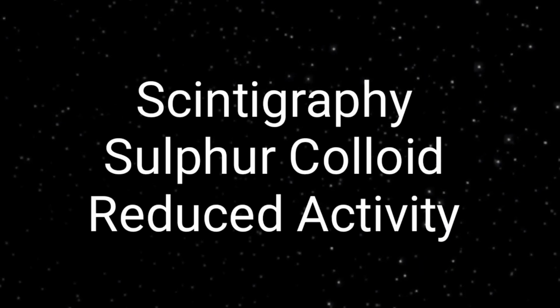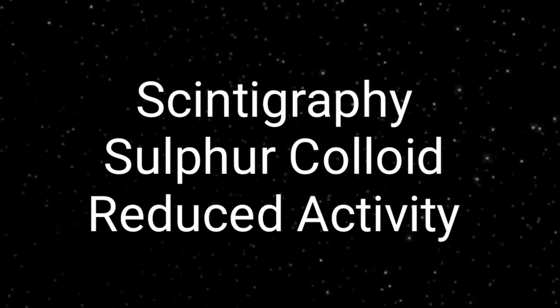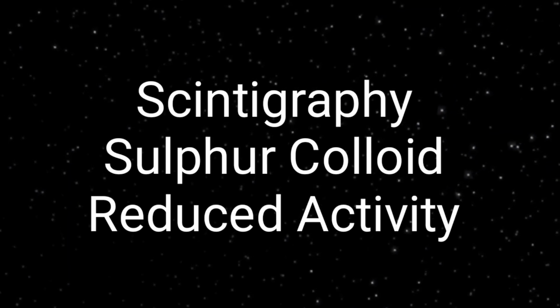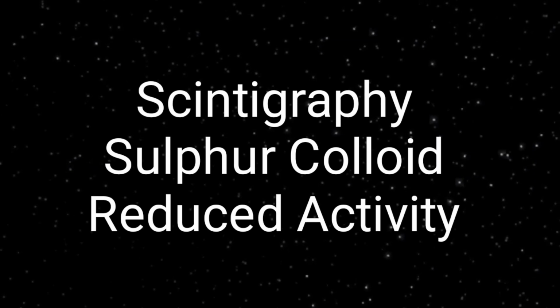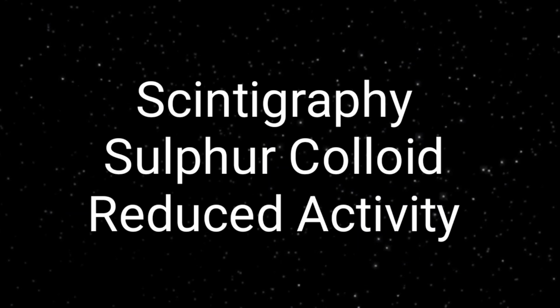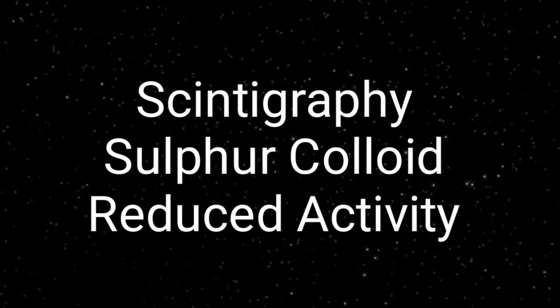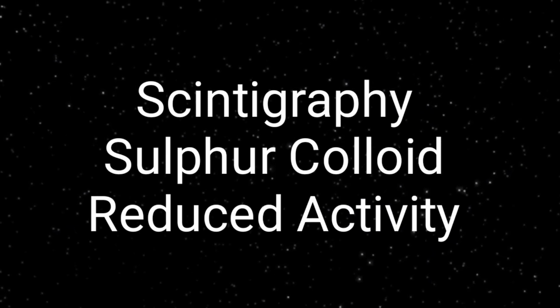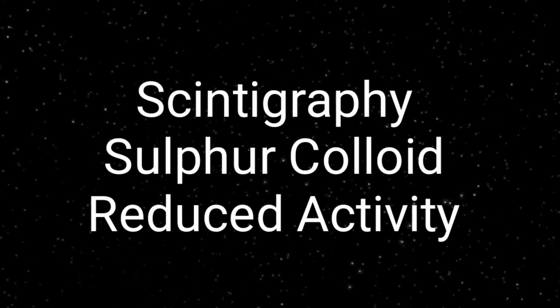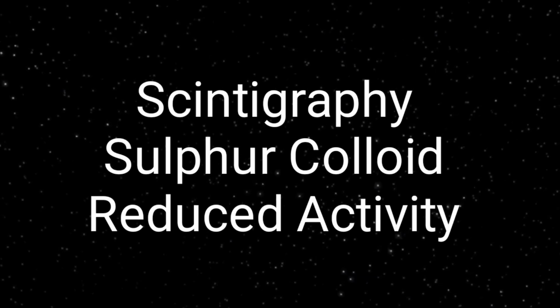Scintigraphy can also be used to pick up and differentiate different types of lesions within the liver. There are multiple scintigraphic radioisotopes available for hepatic adenoma. You can use sulphur colloid, and you can also use the HIDA scan and DSA as well. So far as sulphur colloid is concerned, a hepatocellular adenoma shows reduced activity on the sulphur colloid scan.